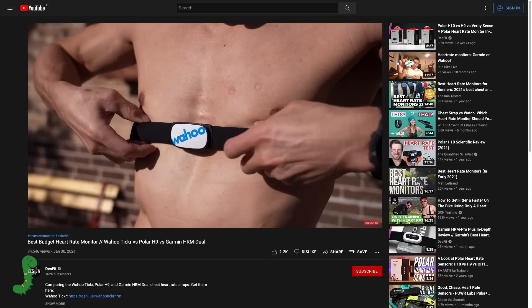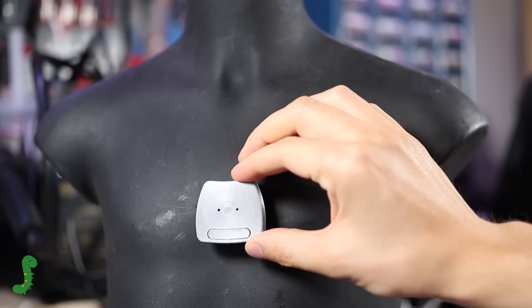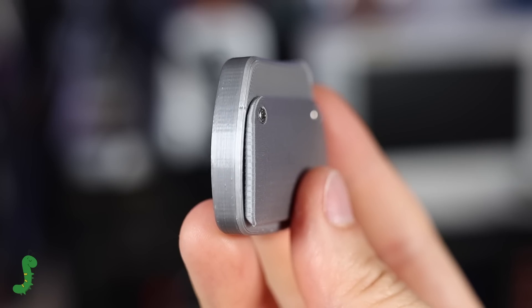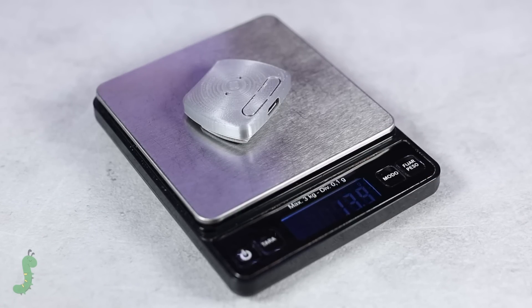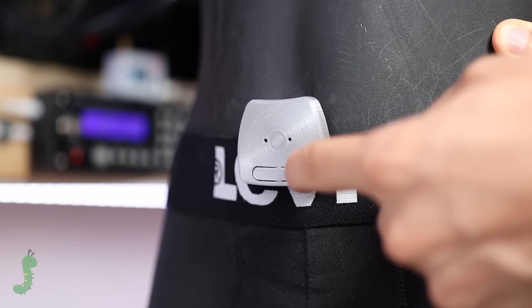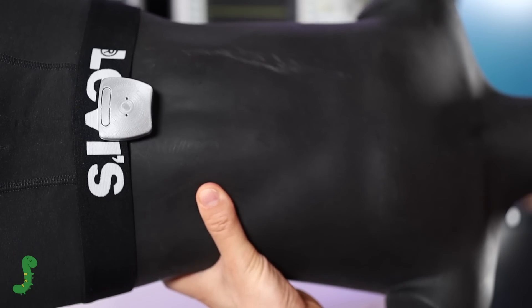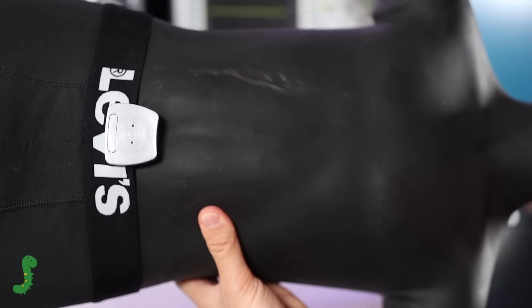I could have used a strap to hold it on my chest, but using the elastic band of my underwear seemed like a simpler solution, given the fact that this device weighs less than 14 grams. To use it, you just have to press the ON button and that's it.